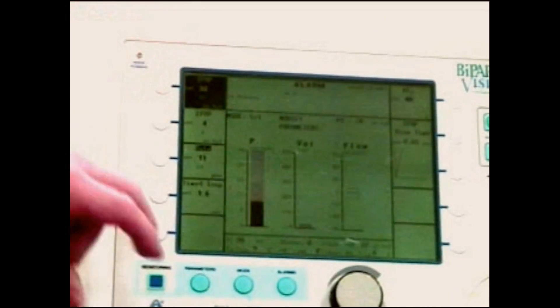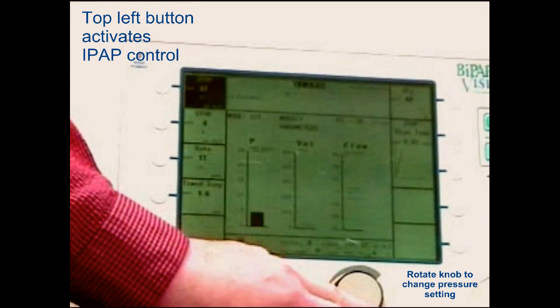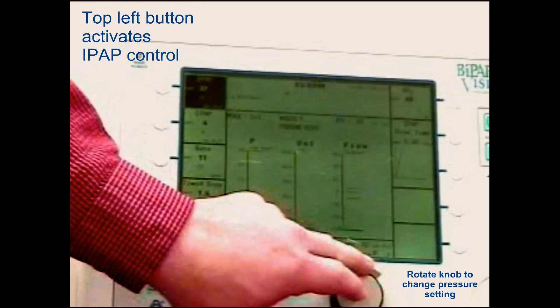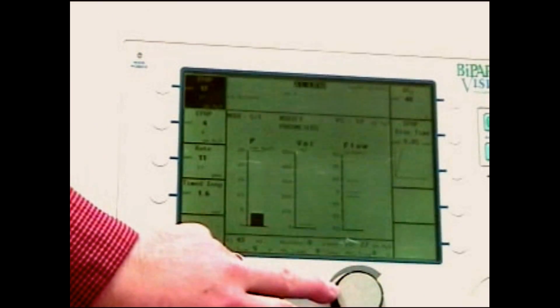Dial in your IPAP pressure, press the button next to it, and dial it to your IPAP pressure. We'll set it at 15.